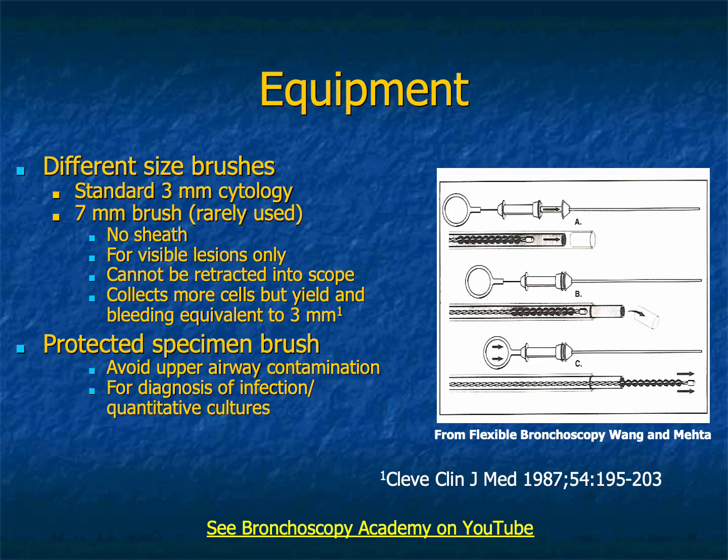The equipment itself varies according to purpose: standard cytology brushes, larger brushes, protected specimen brushes designed to reduce contamination. The choice of instrument reflects procedural goals. Diagnosis of infection may require different considerations than diagnosis of malignancy. Eventually, the bronchoscopist learns that instruments are not interchangeable.